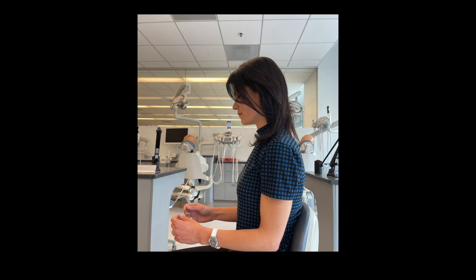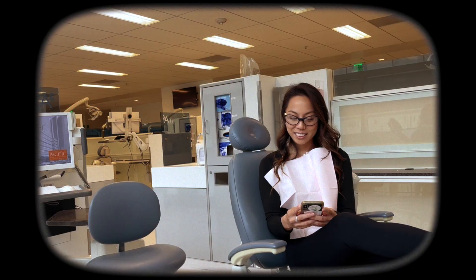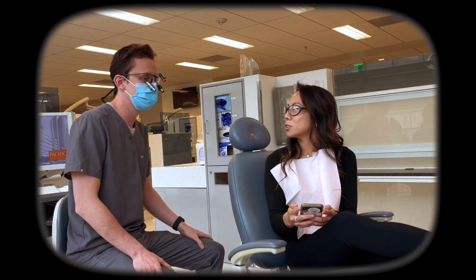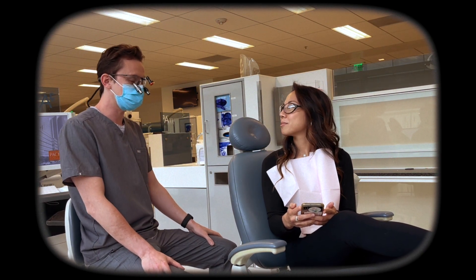Step two: maintaining your position from step one, hold the tape measure in one hand and draw it towards your eyes with the other hand. Measure the distance between your eyes and the base of the tape measure as shown.